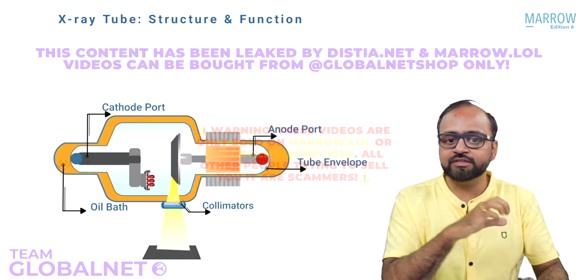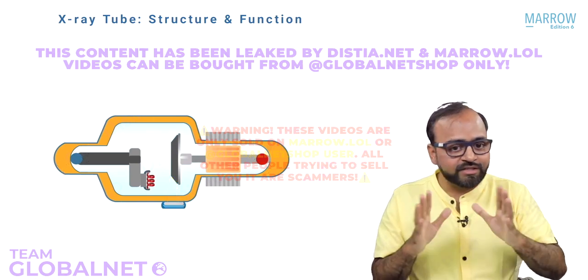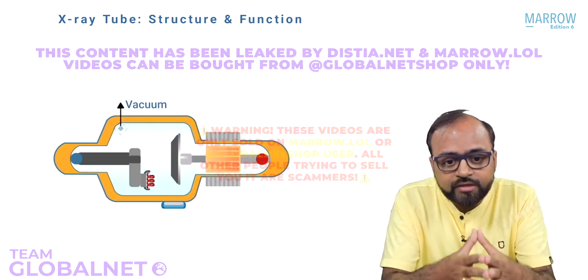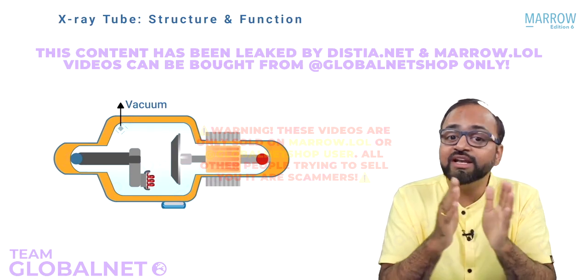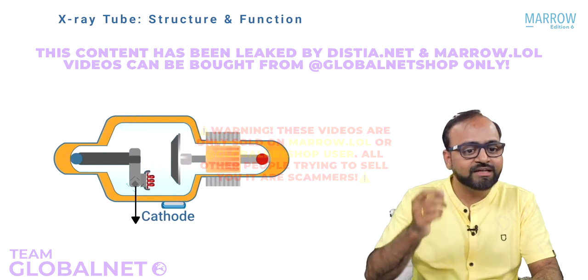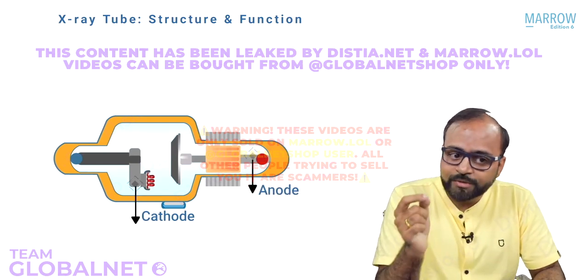So this is how the external structure is. Now let us go inside the tube. Now inside the tube you will find is vacuum. So inside the tube envelope there is vacuum, and in this vacuum there are two important electrodes which are placed. One electrode is called the cathode, the other one is called the anode. We are going to study them in detail.